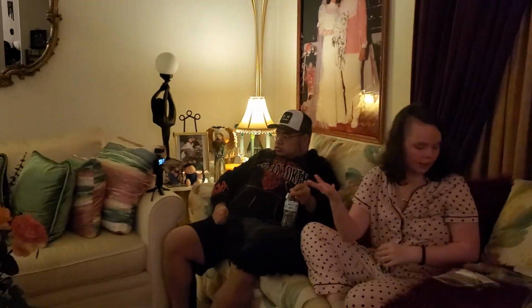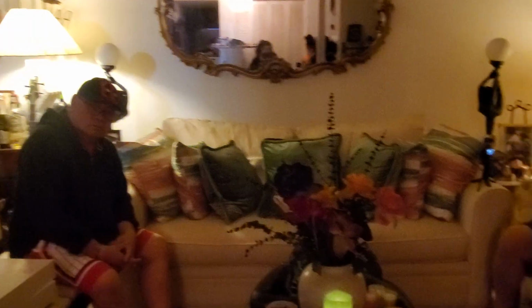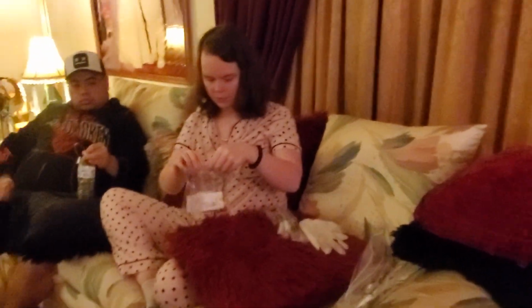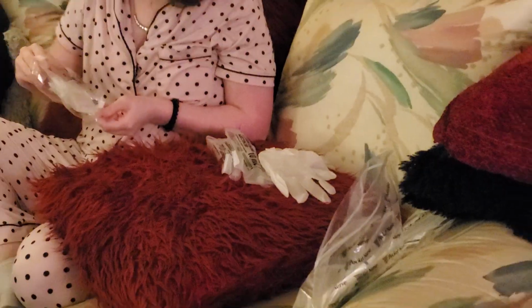I'm looking on the computer at the orders and I see that I have an order for a blood draw, usually for some kind of lab. So I'm going to gather my supplies. I need 2 flush syringes, gloves, however many test tubes the test calls for. I've been practicing with 2.